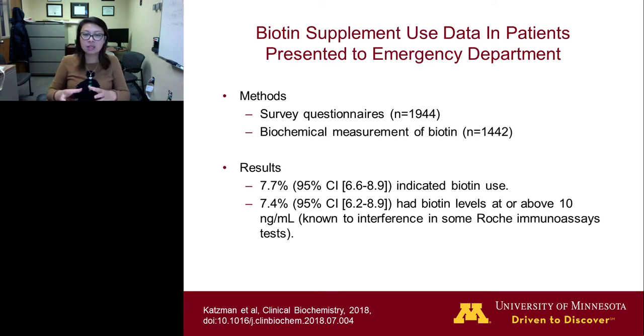So this study complemented the FDA safety communication that illustrated that biotin interferes with lab tests, particularly troponin tests, which could be an issue in the ED. And so to answer the question of whether any test could be impactful enough that the manufacturer would consider changing the method to prevent biotin interference, this would be the test that will change the scenario.